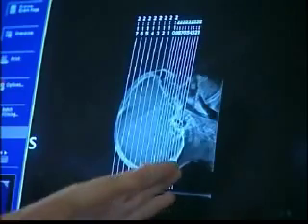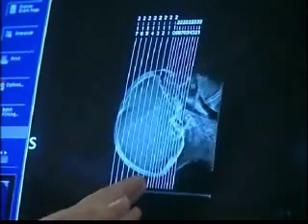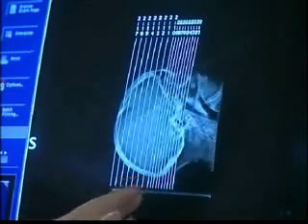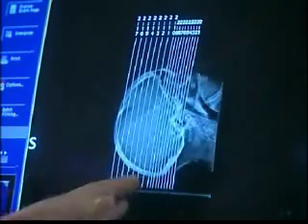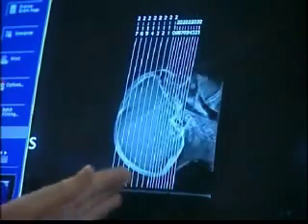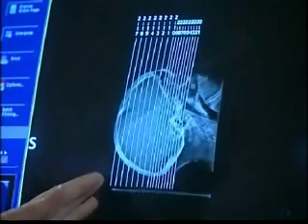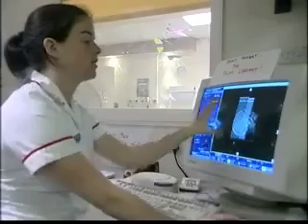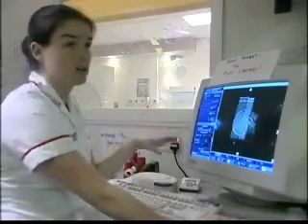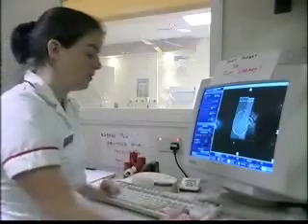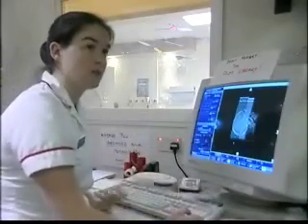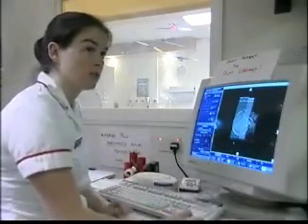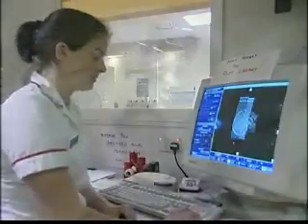We're going to do thinner sections through the base of the skull, and then we're going to do wider ones as we go through towards the top of the skull. So now we can do our actual scan and produce the actual images that the radiologists will look at.